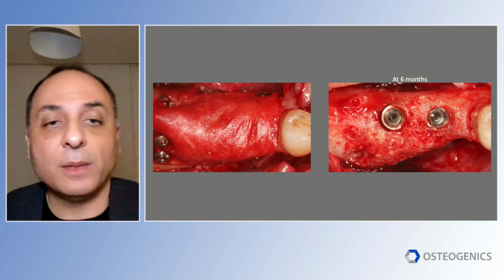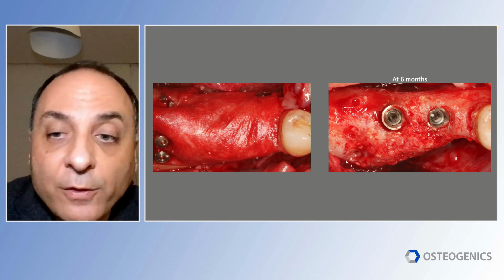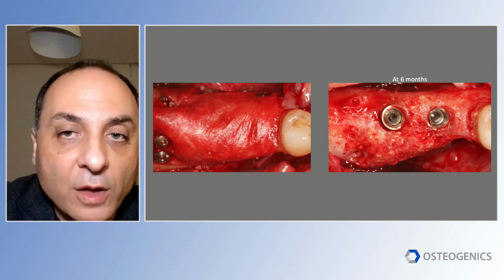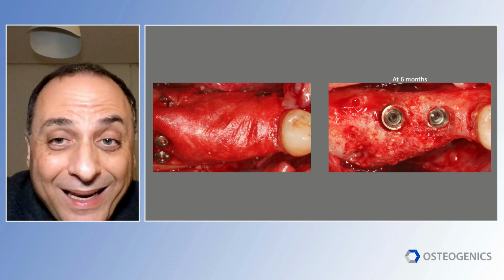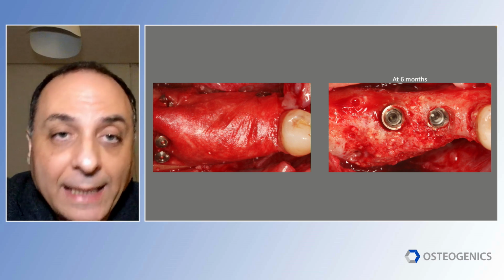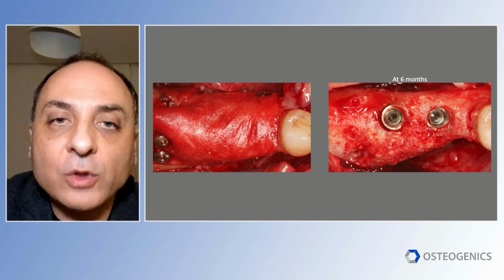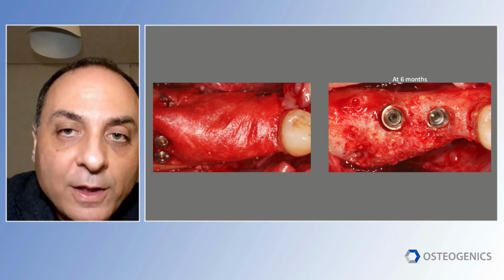And look at this before and after. I invite you to closely examine the difference. How much bone volume do you think I've lost? Probably 5%, 10% maximum. And this is consistent. It's been like 10 years. Every time I use this combination, it's every time.